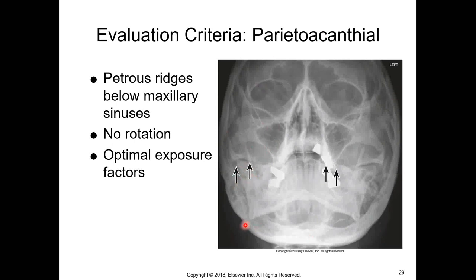You want to make sure that there's no rotation, and you want to make sure everything is well penetrated. So you can see your maxillary, ethmoids, and your frontals here. Your sphenoids are superimposed right now by your teeth.